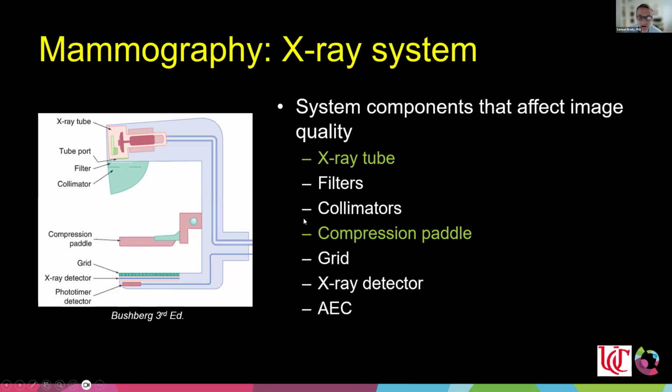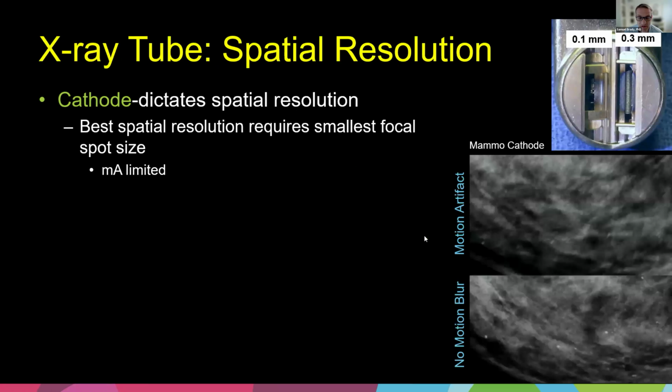But one of the things I'd like to talk about is a subtle difference between the X-ray tube design and, of all things you're probably going to think about, I'm actually going to spend most of my time talking about the compression paddle, because I think these two areas are some of the best ways for us to optimize X-ray based mammography systems.